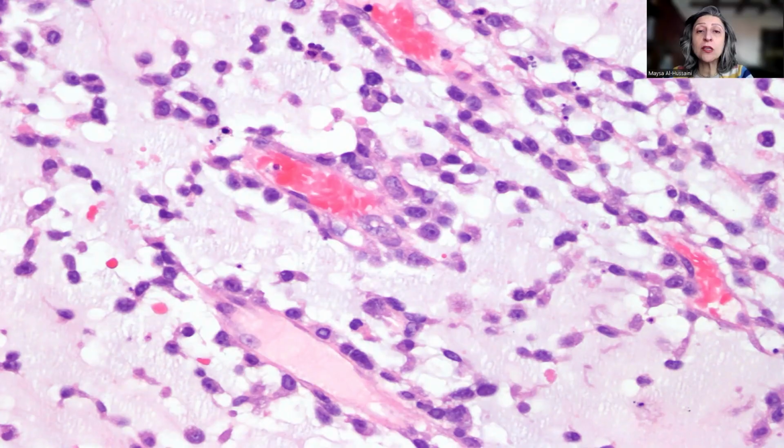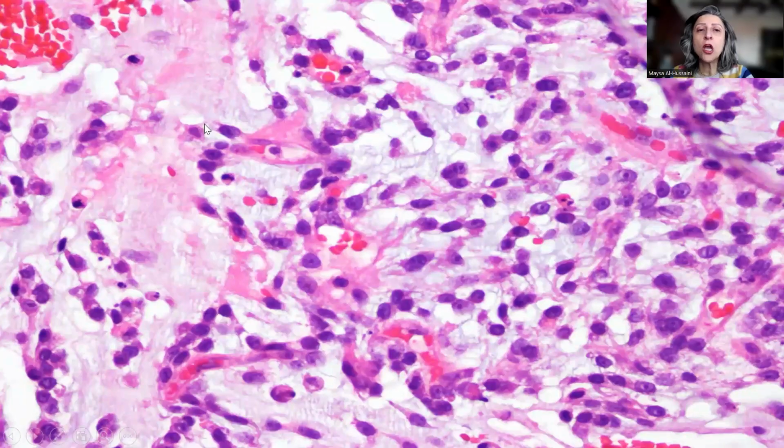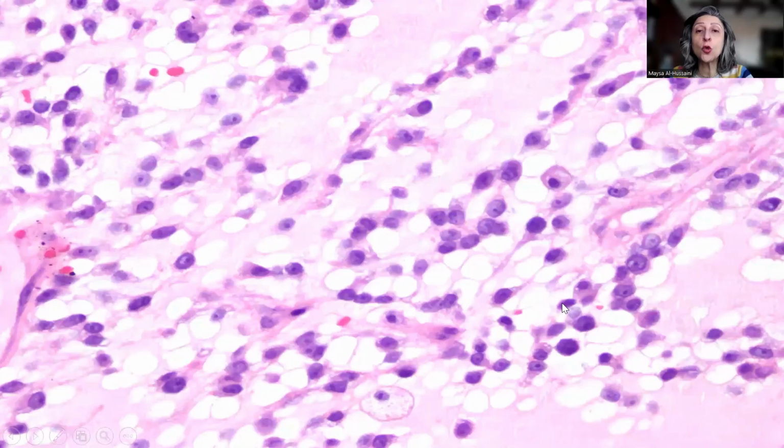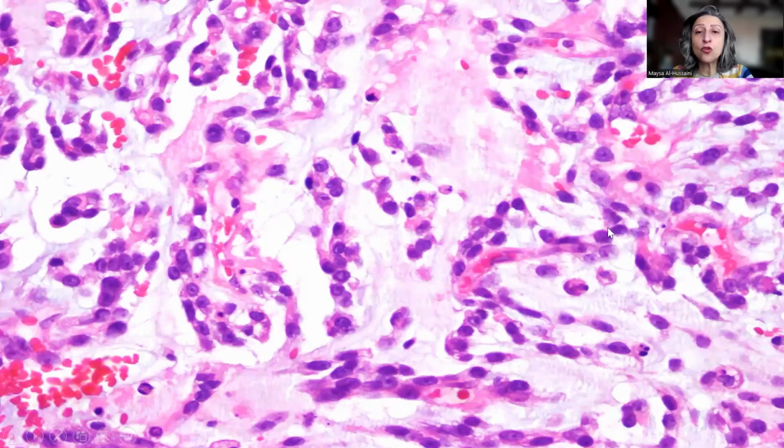And then the granulosa cell tumor can show a variety of growth patterns in addition to some scattered mitotic activity here and there. Look at the appearance here. If you don't think of a granulosa cell tumor, probably you will not order the appropriate immunohistochemistry to support your diagnosis. And look here, look at the cell with the vesicular nucleus and the prominent nucleolus, scattered vacuolization in the background stroma, and more here.